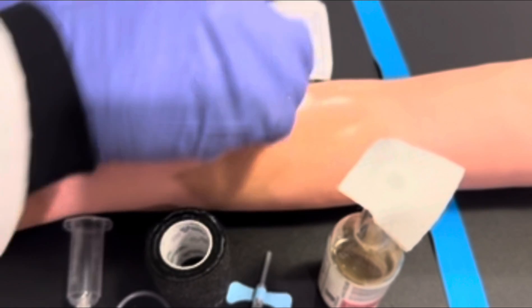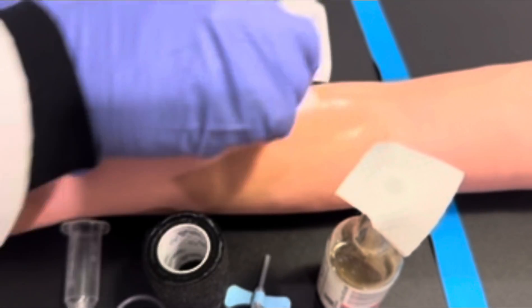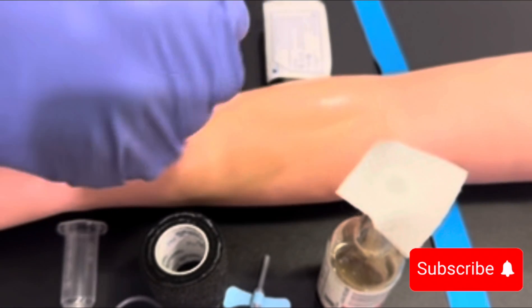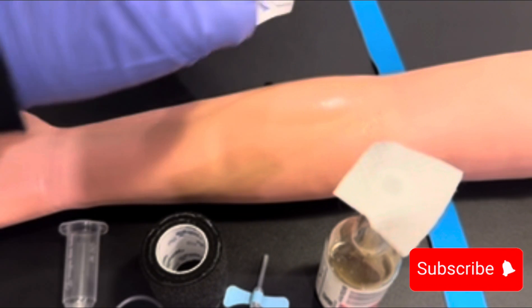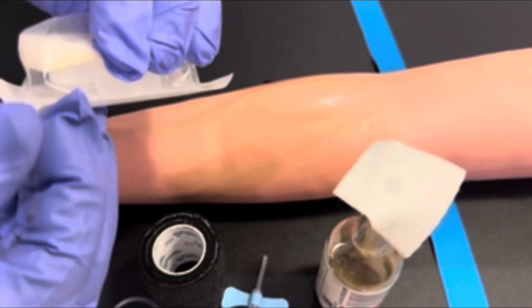The first antiseptic that we will use is 70% alcohol. Please clean the site for 20 seconds using 70% alcohol in concentric circles. And then we will use chlorhexidine.